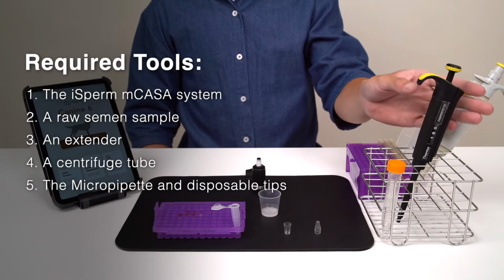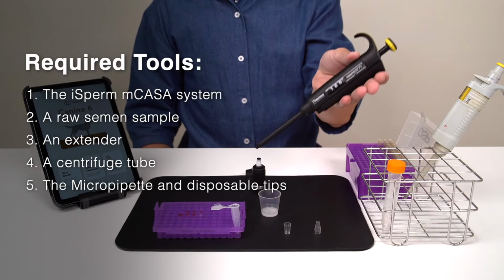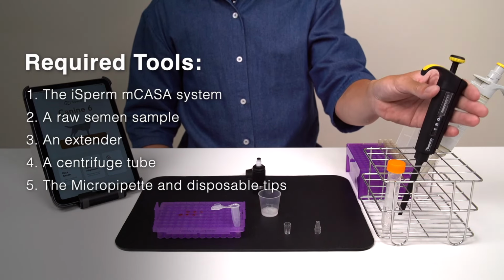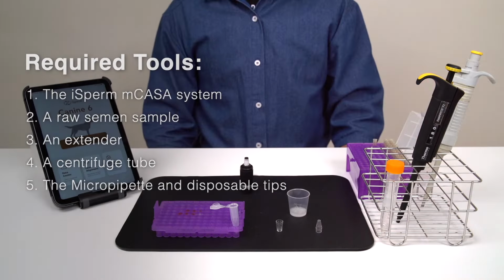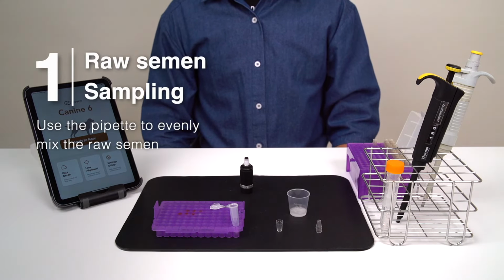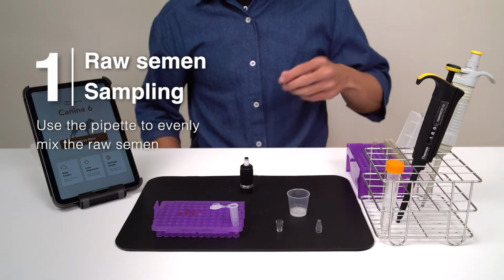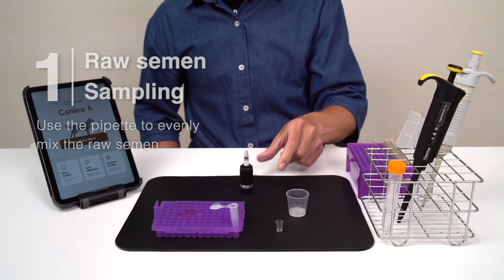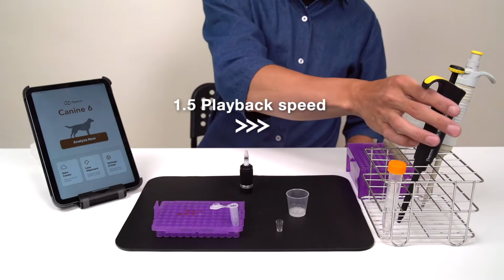Please understand that we have 3 sampling methods for use with the iSperm. However, the pipette method is recommended because it's the easiest and the most accurate one. Step 1. Raw semen sampling. First, we place the base chip on the tip of the sample collector, and then mix the raw semen with the pipette.